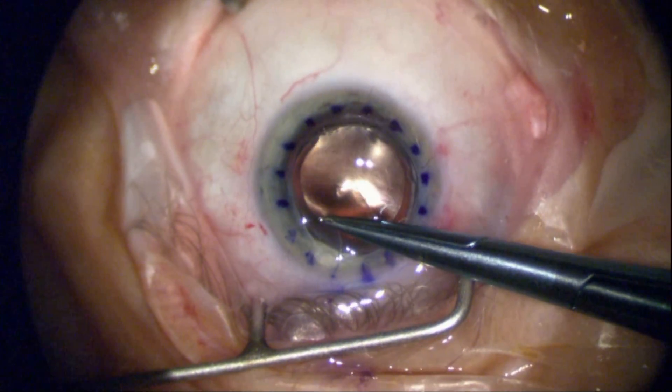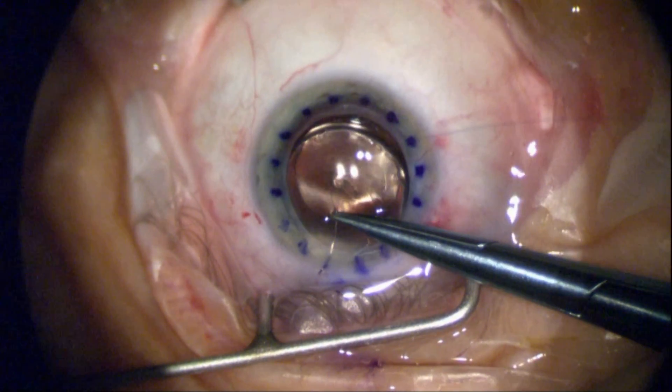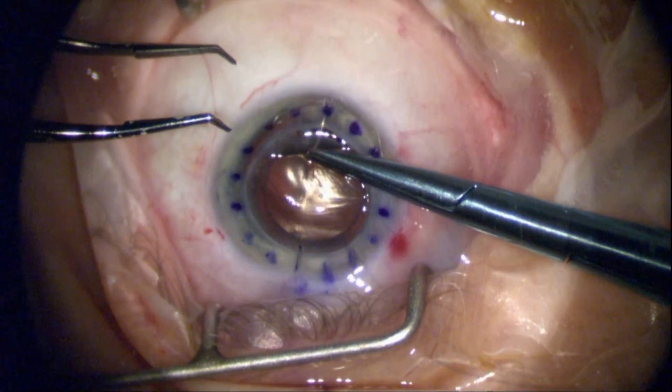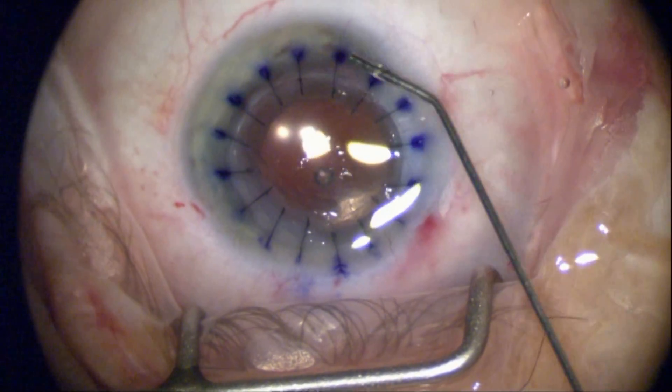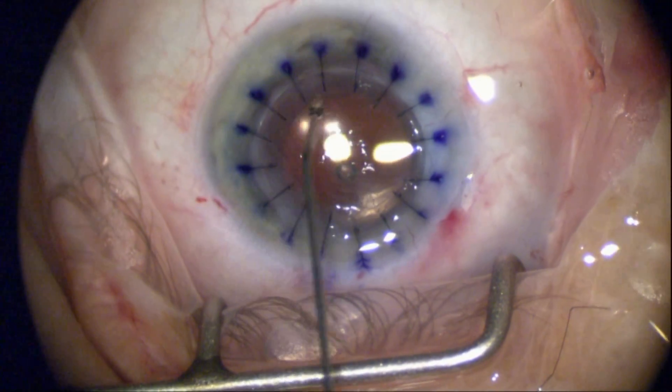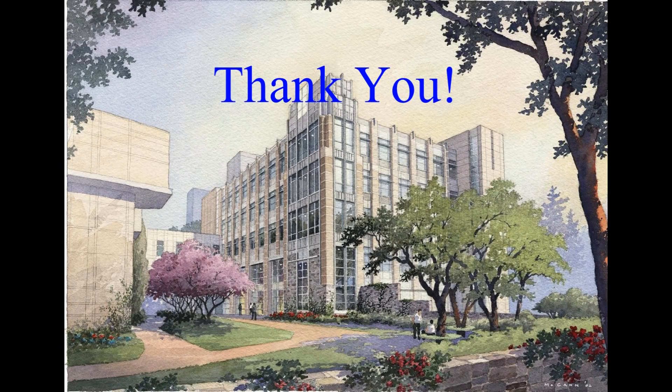I'm using a 10-0 nylon suture — 10-0 nylon sutures are one-fifth the diameter of the average human hair. I've got the tissue in place, the lens in place, and the wound is secure. Thank you very much.